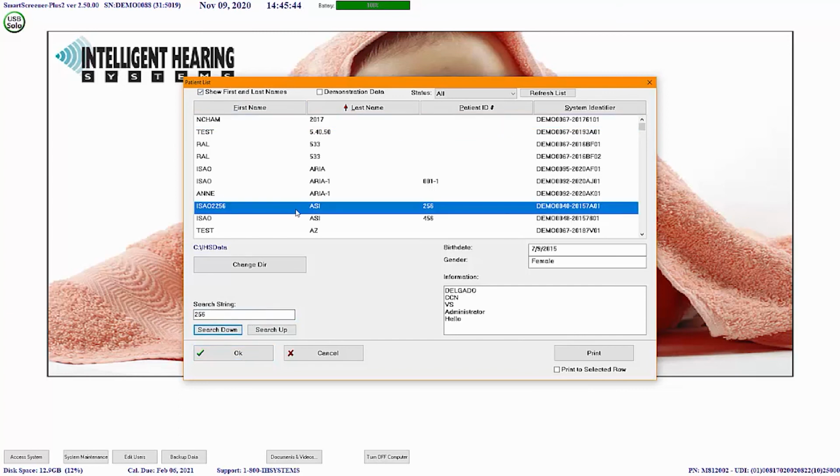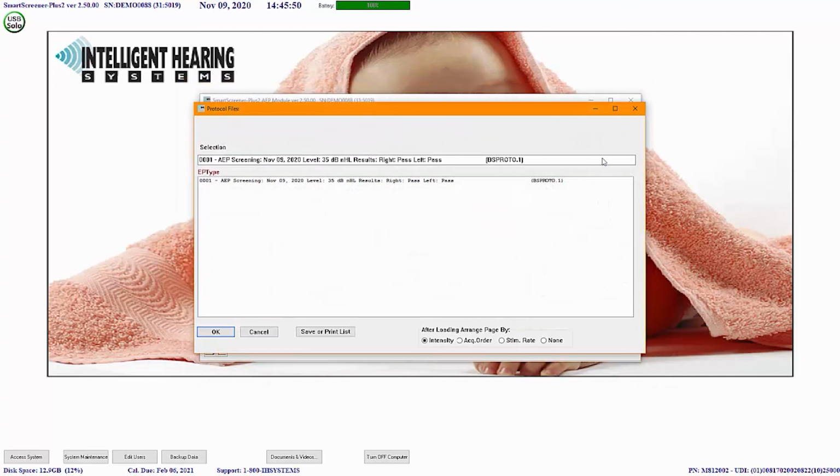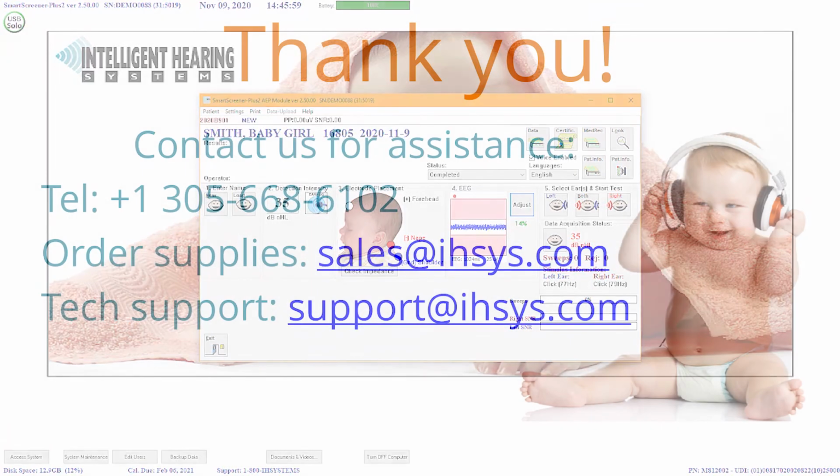You can also click on Look once the patient is open to view the tests that have been done for that patient. Please check the bassinet and the area around the baby to make sure that nothing is left behind, especially the ear hug and electrode plastic backings and the packaging. Make sure to clean and disinfect the cables before carefully storing them on the hooks.